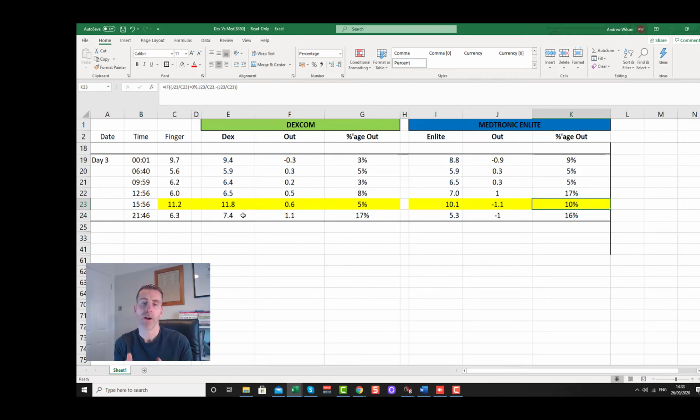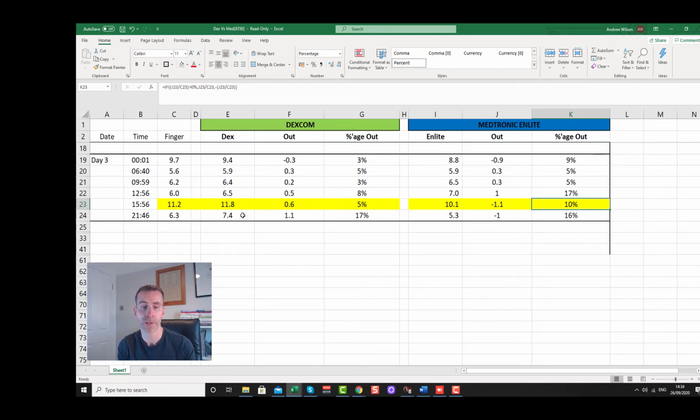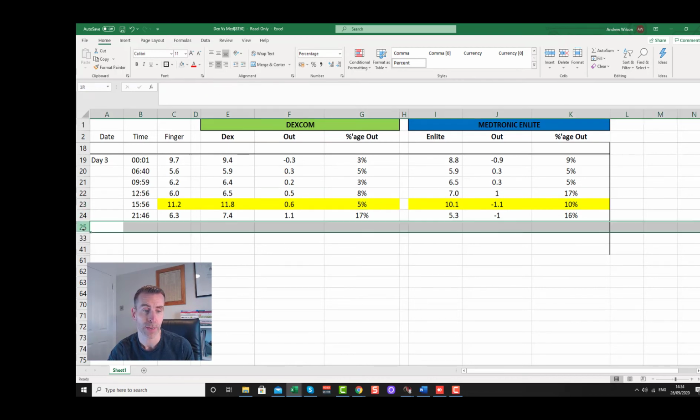Now, again, I refer you back to the MARD system. MARD stands for the mean absolute relative difference. And the Dexcom is known to be accurate at the higher blood glucose levels, so hyperglycemic, and is also known to be accurate at the lower blood glucose readings, which is hypoglycemic. I will show you some of the lower ones, but you can see that is more accurate. 5%, that's pretty damn good.